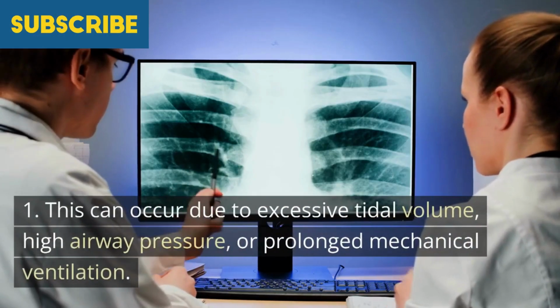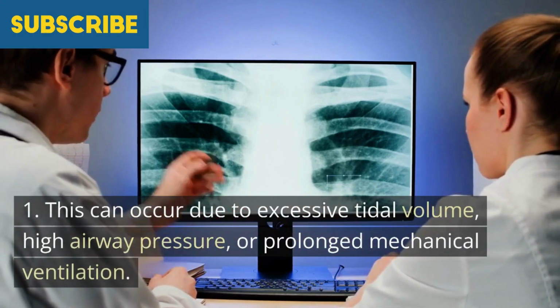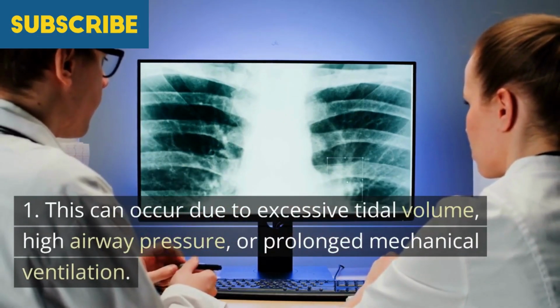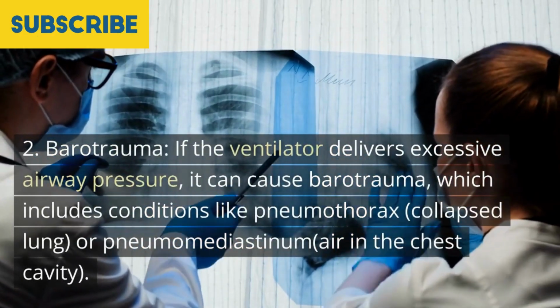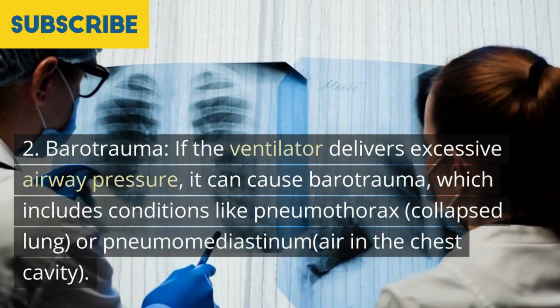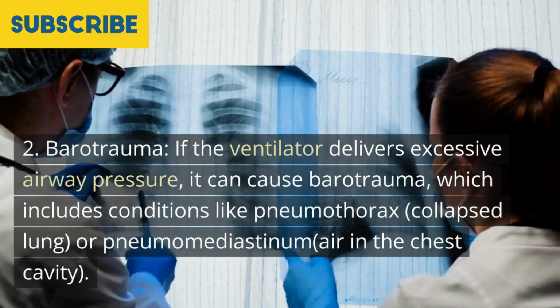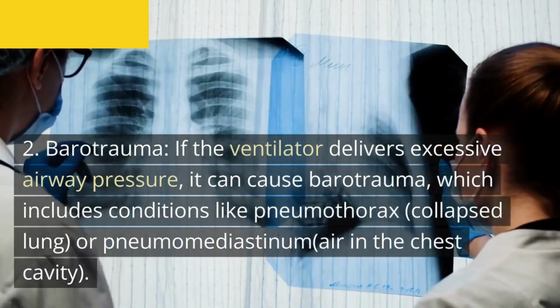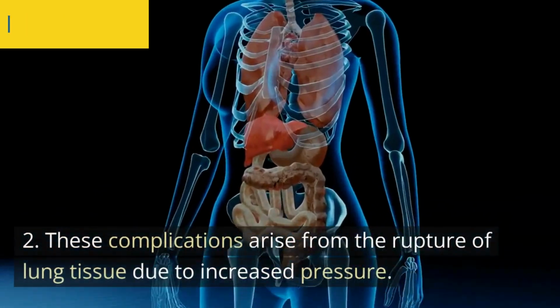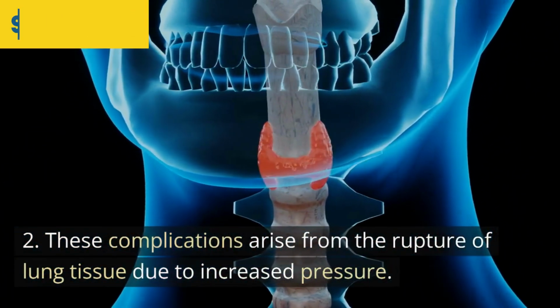This can occur due to excessive tidal volume, high airway pressure, or prolonged mechanical ventilation. 2. Barotrauma. If the ventilator delivers excessive airway pressure, it can cause barotrauma, which includes conditions like pneumothorax, collapsed lung, or pneumomediastinum, air in the chest cavity.